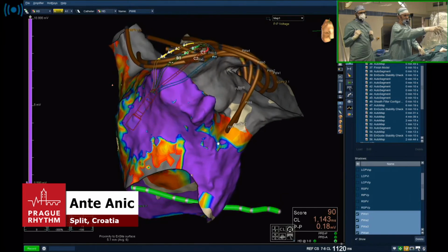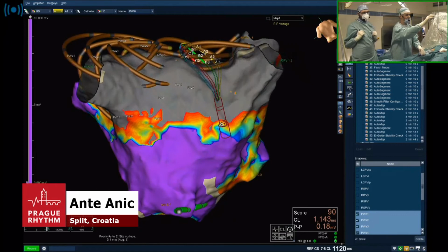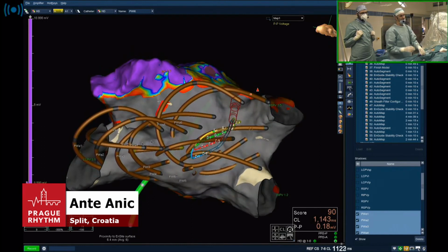And even on our anterior, so because it's a common trunk, the roof part, go to the roof part. You see that we had 7 application sites in the roof part, and we encompass quite a bit of a septal roof, which we like.